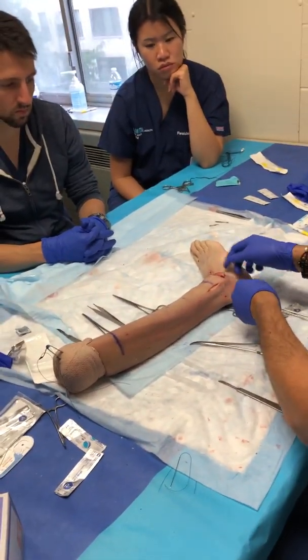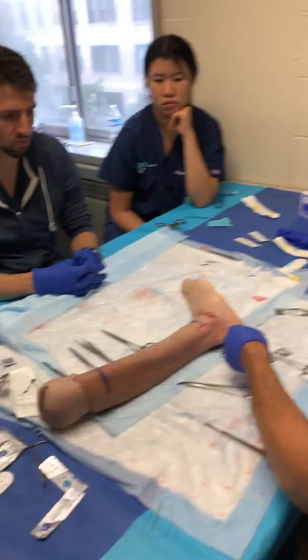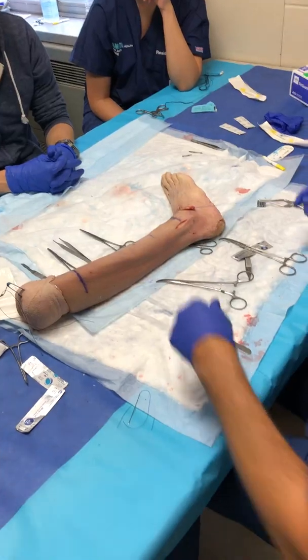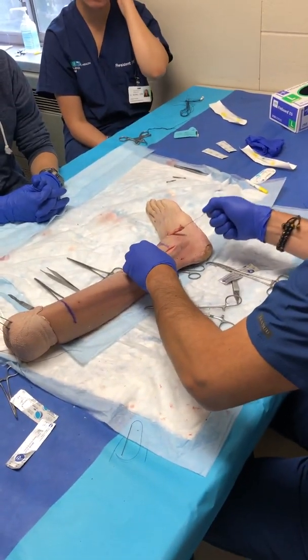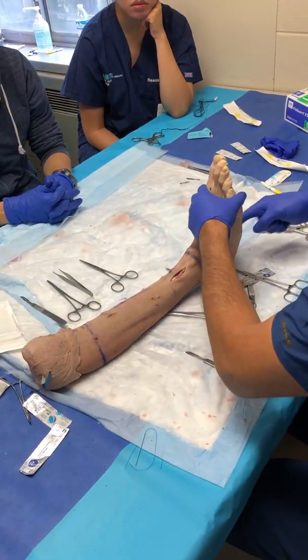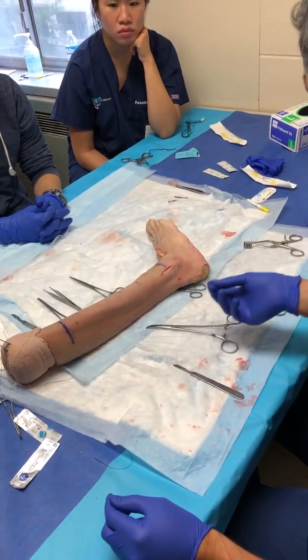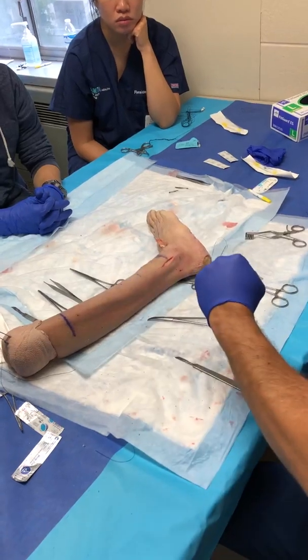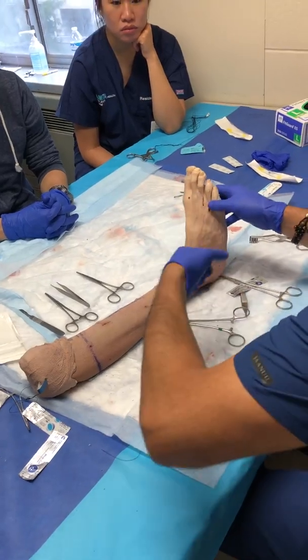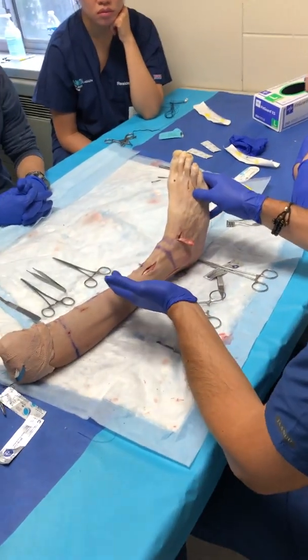Then, what is the suture stage that you start here and start bringing it down? You do that one. Yeah. Or a Bunnell, either one. Either Bunnell or Krackow. Okay? Why? Because you want to have a good pull on the tendon. Put the foot at maximum dorsiflexion. You're gonna pass all these sutures. They have a Keith needle, or you go right through the bottom of the foot. You pull really hard, and while someone's pulling the tendon and holding the foot, you're putting your interference screw in that hole. Okay?